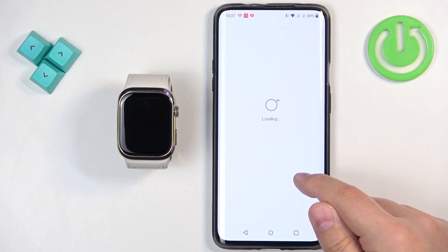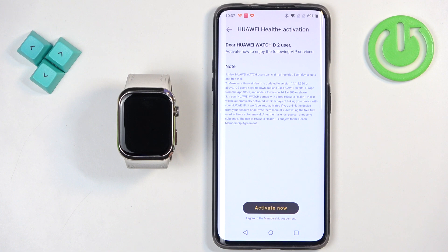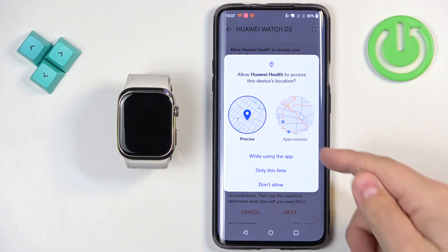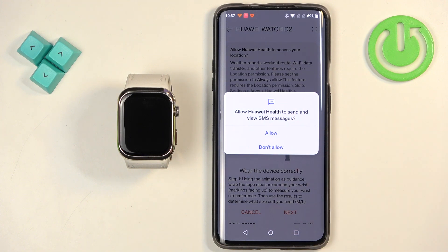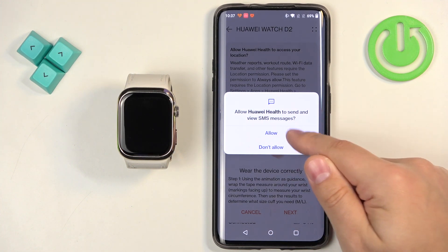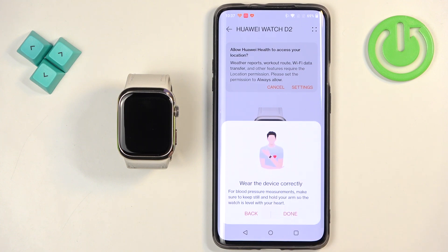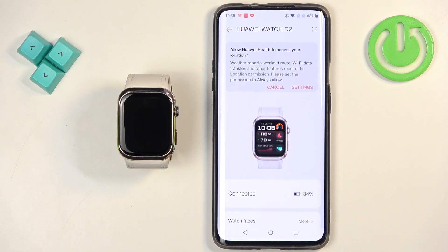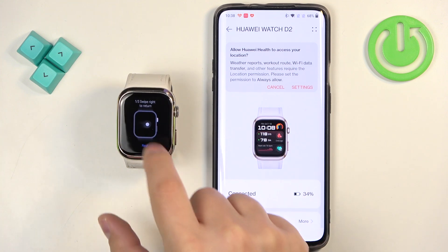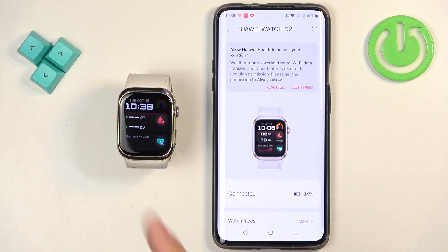Tap on done. Allow ordinary permissions for notifications and location. We also have calendar and call log access — these are needed for notifications. There may also be a subscription plan pop-up which you can skip. Once all the permissions are done and the tutorial is complete, you will see the device page for the Huawei Watch D2. If you wake up the screen on your watch you can go through the tutorial, and once done you should see your watch face — that means the devices are paired together. That's how you pair this watch with an Android phone.